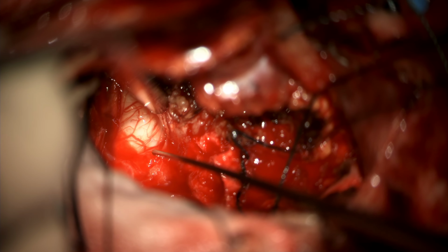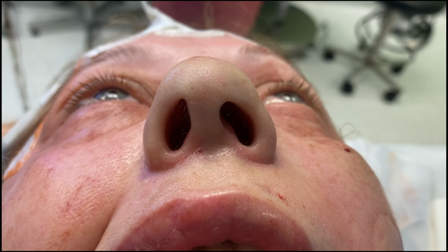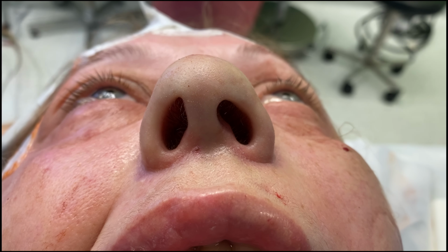And now, let's do this. Go do that again. Stimulate again, right on the nerve. Good. Again. Good. Okay, and you're at 0.07. Very nice. So there was a little stronger on the other, but she does move on the left. Yes, on the left a little bit. There it is. Let's just wait till we get a real good one. There, that was one.